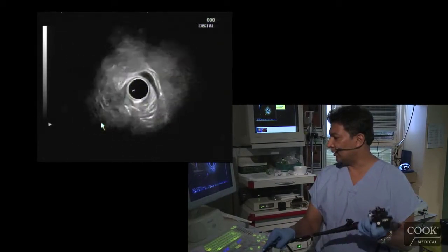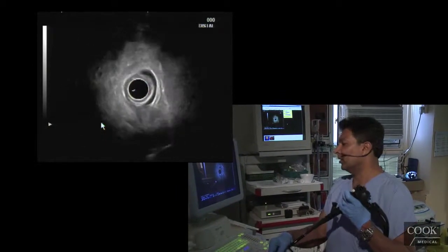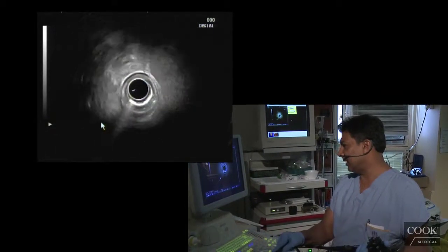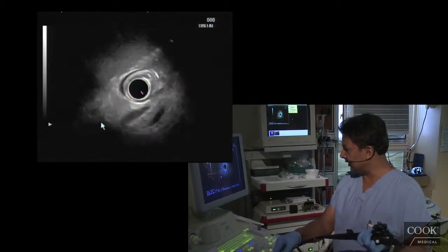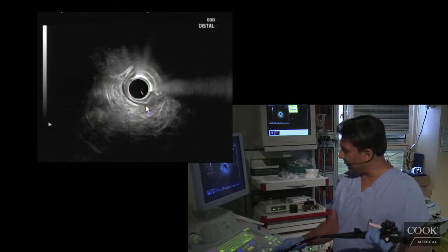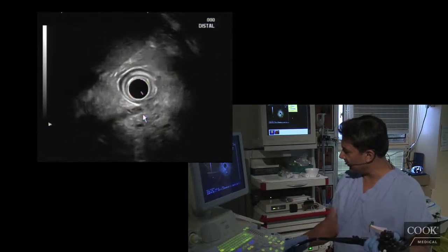To get the station — what they call it with the radial — you go into the bulb, put the balloon up nice and big, just kind of go in the apex. I like to actually go a little bit past the apex, then tip up, torque left and pull back. So you can see the bile duct right here. There's the ampulla. He has a bit of a straight shot, so we go straight into the D2, and pulling back, there's his bile duct there.